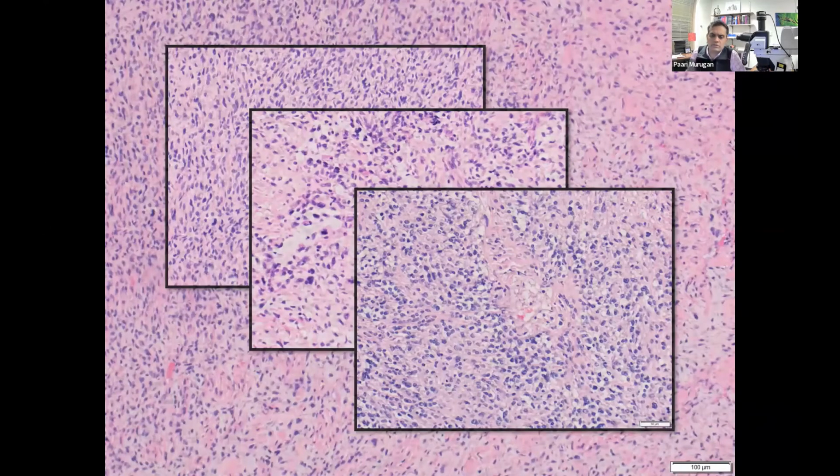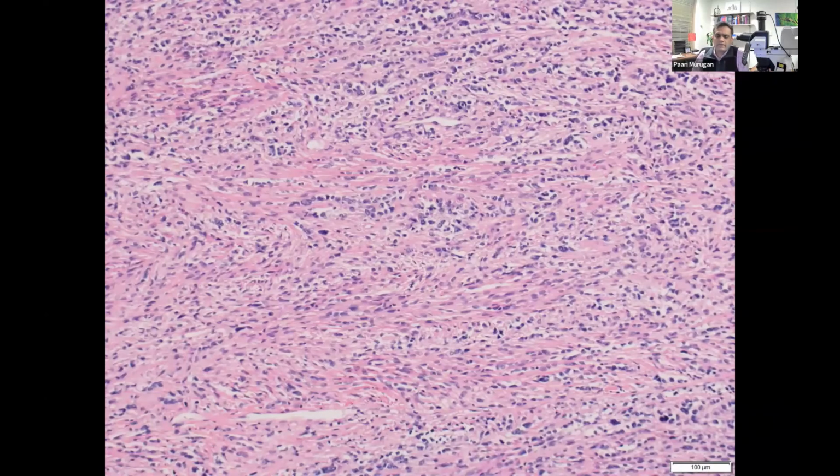So more images of these areas. You can see they also form some peculiar patterns, what we might call a linear group, or popularly known as the Indian filing arrangement. So we can see that here, almost looks like a lobular carcinoma of the breast. And these are intersecting in between the fibrous spindle cell areas.